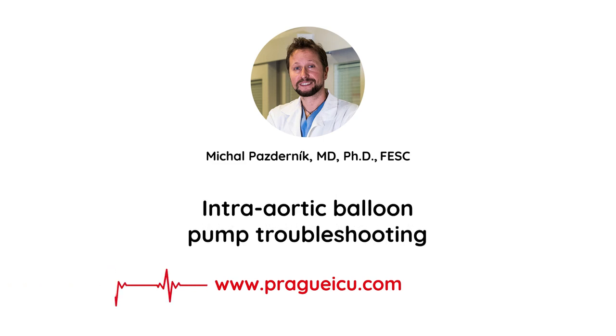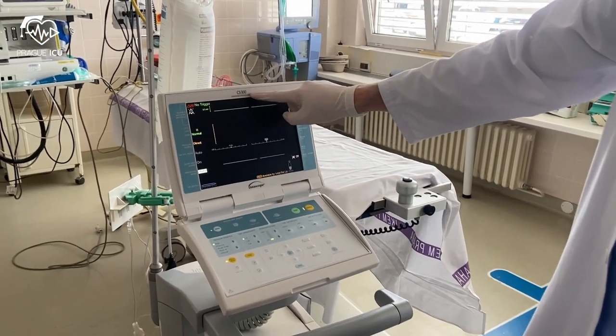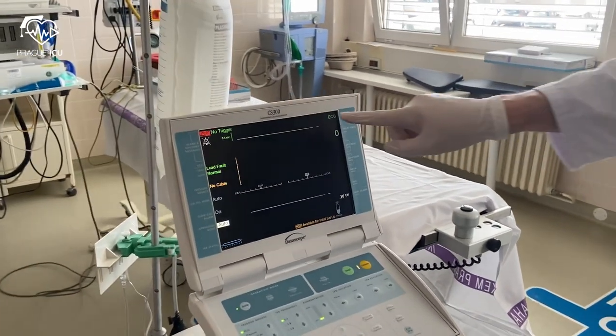Hi guys, this is Mikhail from Prague ICU, and today I will show you the setup and troubleshooting of an intra-aortic balloon pump counterpulsation. In this demonstration, we will use the CS300 console.